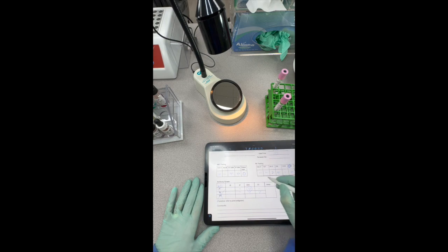So now our Rh interpretation on this, because our weak D was positive, it came up positive. Okay. We are going to interpret this as Rh positive. Okay. So this patient is O positive. That weak D came up, so we want them to be O positive.